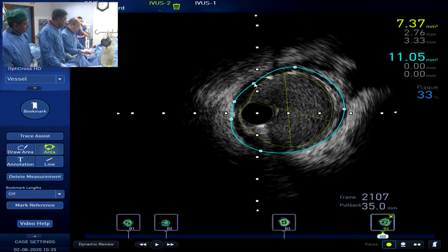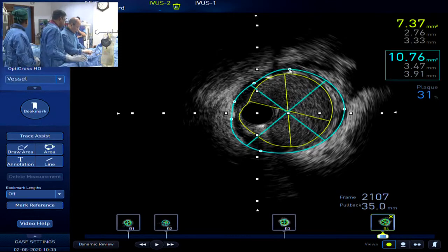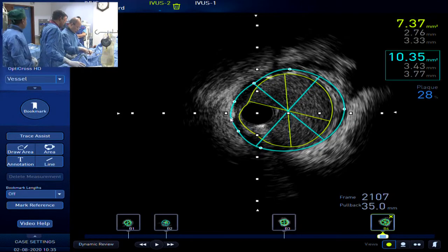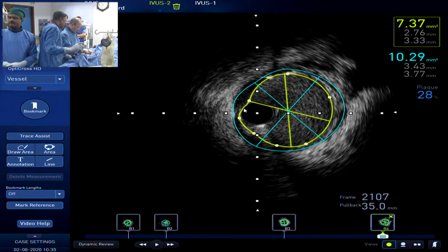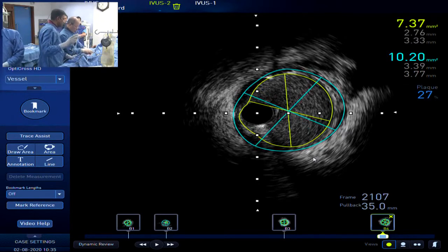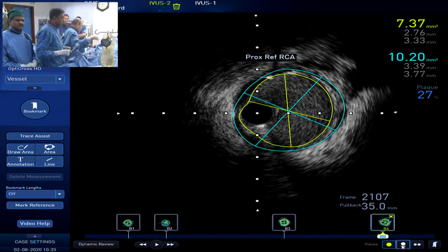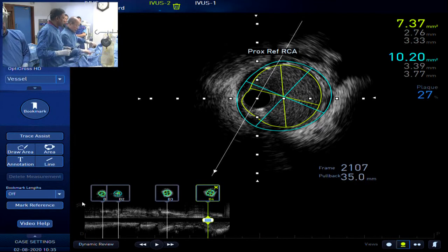Malcolm, have you? I don't recollect having seen that. The reason why I've asked is, fortunately, I do very few of these very complex CTOs, so I don't have a very high rate of perforation. But I've seen some cases where we were doing intravascular ultrasound, and in retrospect, you could actually see the effusion beyond the vessel. In one particular case, we didn't recognize that the patient had a large effusion, but it was first recognized from the intravascular ultrasound.